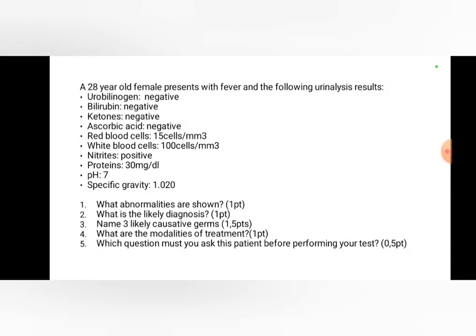In the case where you have unconjugated hyperbilirubinemia, though there is a high level of bilirubin in blood, there is still no bilirubin present in the urine, just because unconjugated bilirubin is not soluble in water. Are you understanding? So those are the different elements. As a point of summary, urobilinogen, when it is present, is a marker of a high level of unconjugated bilirubin.